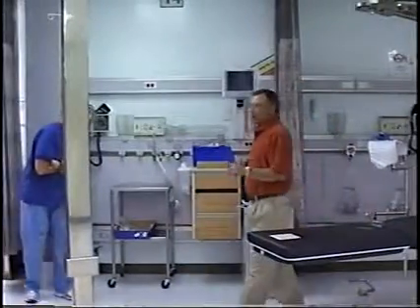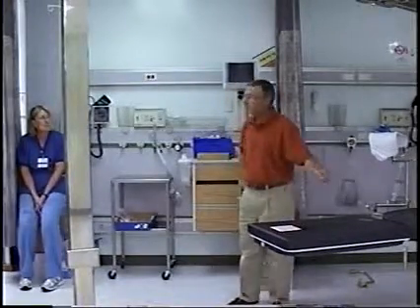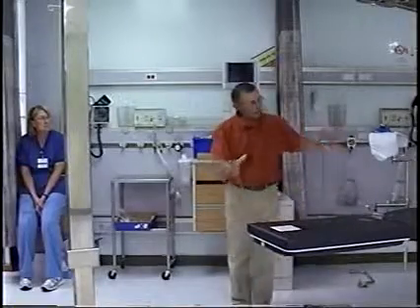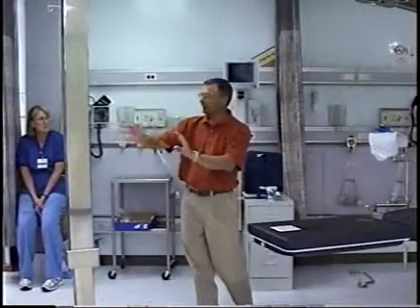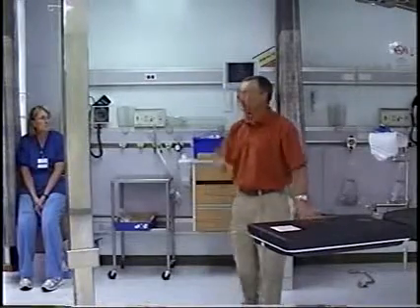The last thing I'm going to show you before we finish this evening is how to set this up in what I call the storage mode, so that if it's set up that way, when you come in, all you got to do is just unfold it, stretch it out, and you're ready to go. Okay? You want to help me break this down, Mike?